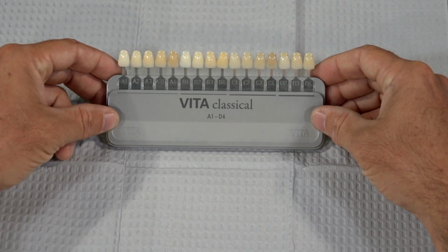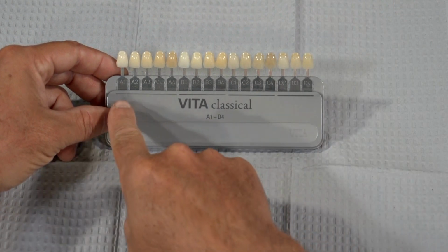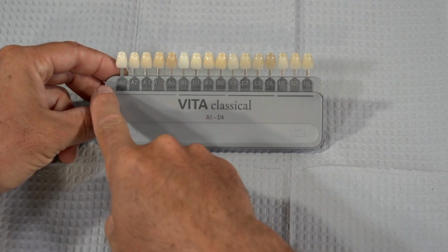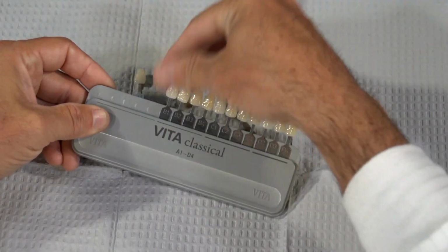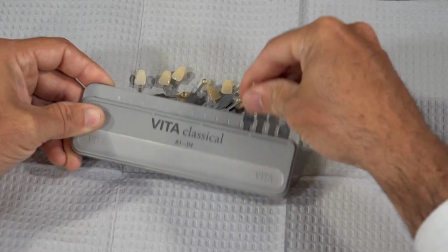Let's look at the Vita Classical Shade Guide. Now, it's one of the most popular shade guides used in dentistry, but it doesn't communicate all three of these ideal parameters to select the shade, specifically the shade's value. The Vita Classical Guide is still a great tool to use to assist us in the decision-making process, so I'm going to ask you to get a little crazy and do something just off the wall. I want you to take all the tabs out of it and rearrange them.